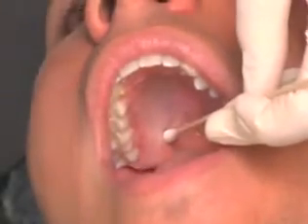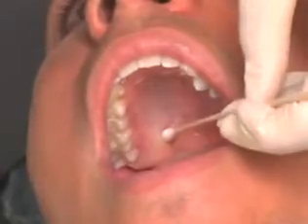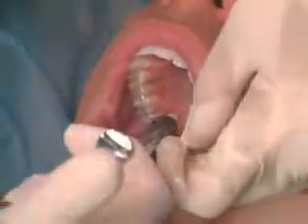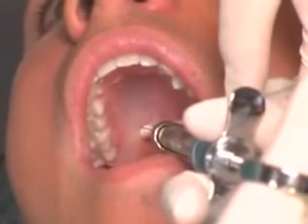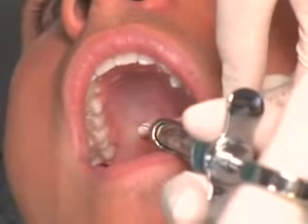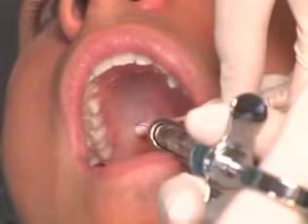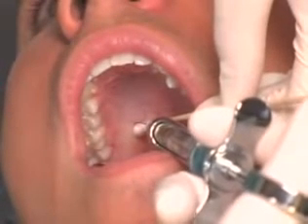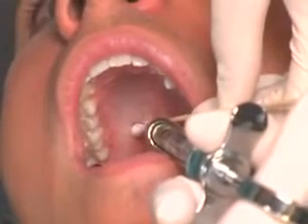A cotton swab is placed in the patient's mouth to palpate the greater palatine foramen. The needle is inserted into the soft tissues just anterior to the greater palatine foramen. As the needle is advanced through soft tissue, local anesthetic is deposited. On contacting bone and following negative aspiration, one-quarter to one-third of a cartridge of local anesthetic is deposited over 15 to 20 seconds.